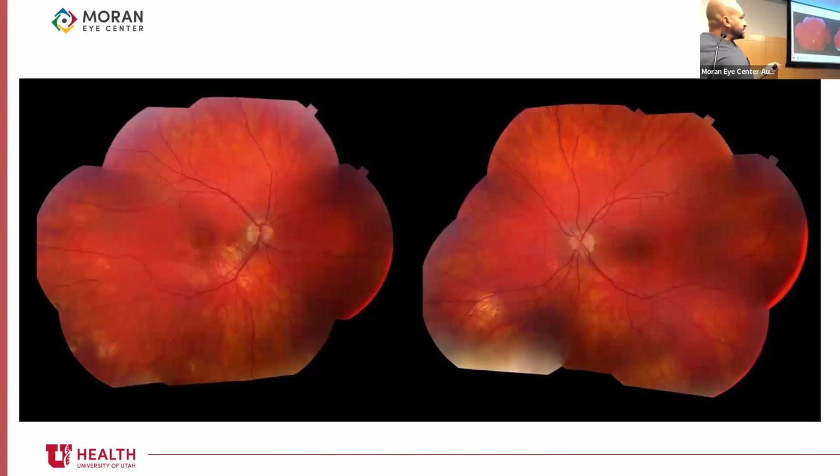So when we saw her in clinic, I don't know if these pictures, are they showing up? Is it, I think we should turn these lights down a little bit. I got it. You can see it.